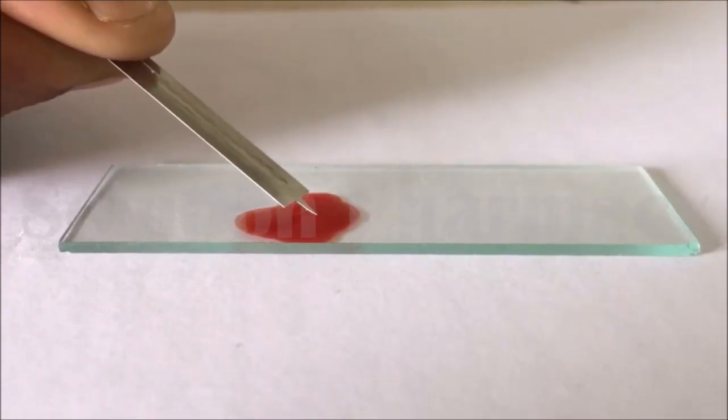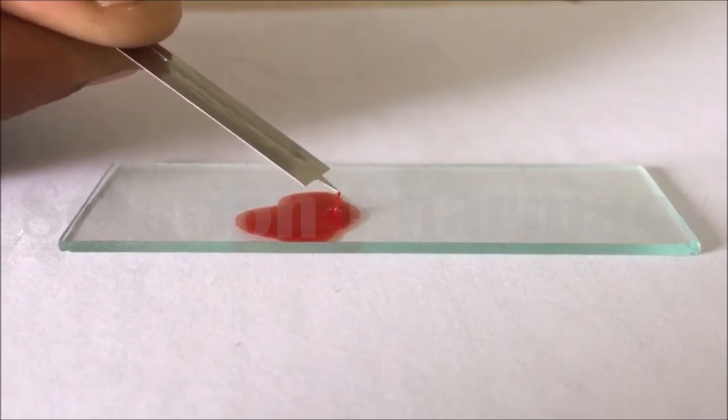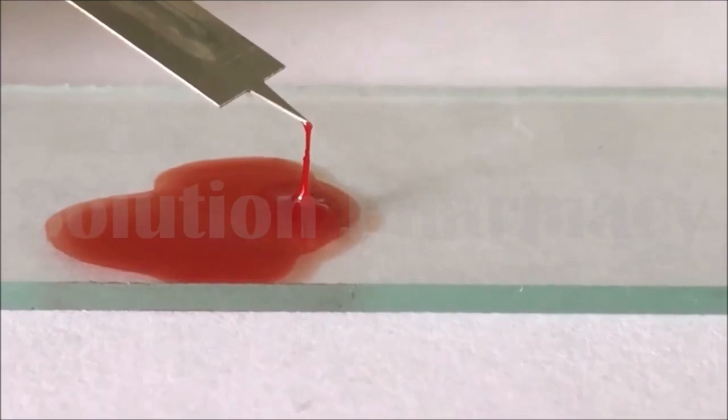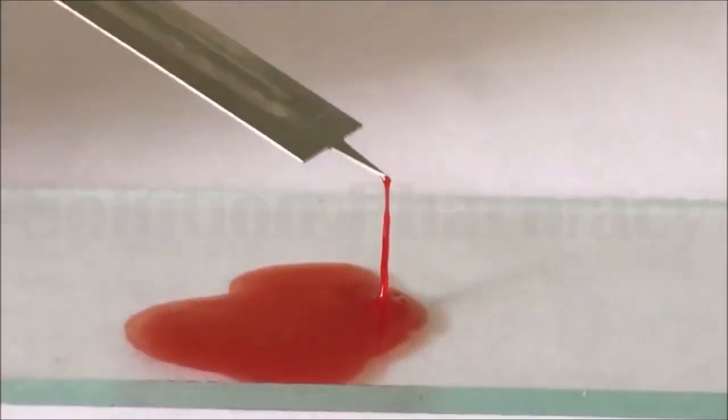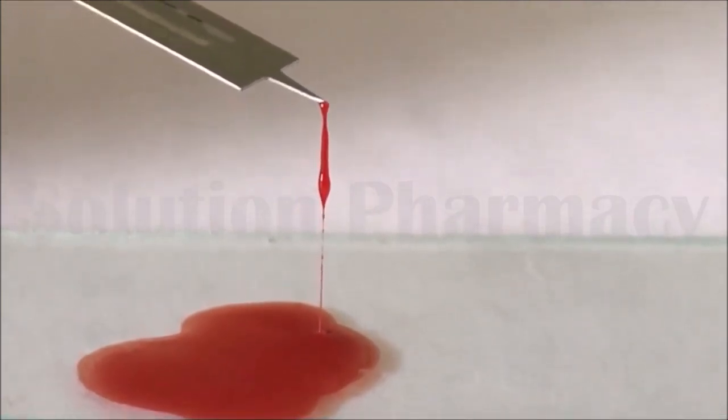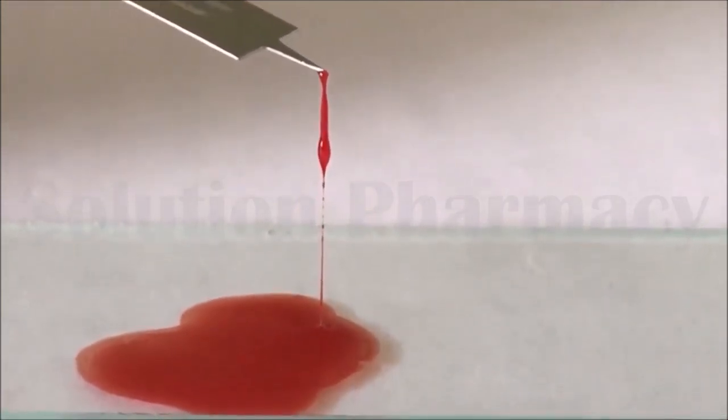pull the blood drop on the slide with the help of the lancet tip. Pull upward slowly. You can see here a fine thread, that is the fibrin thread of the clotted blood. Note the time, and this time is called the clotting time of our blood sample, which is determined by the slide method.